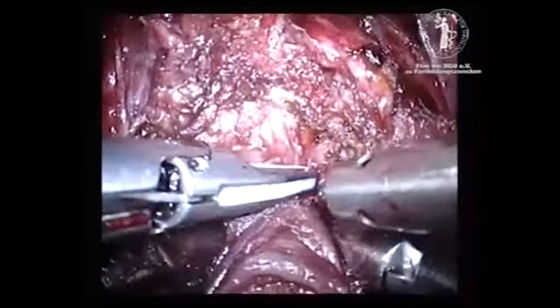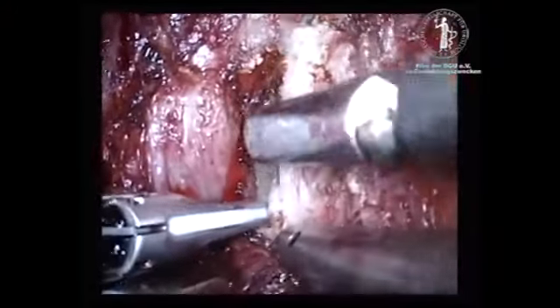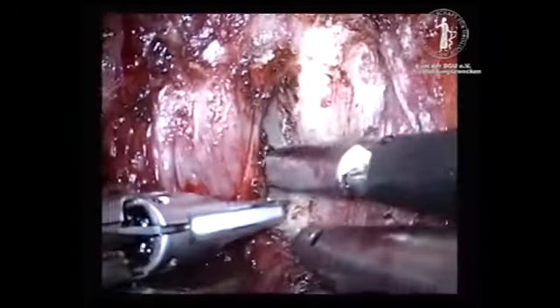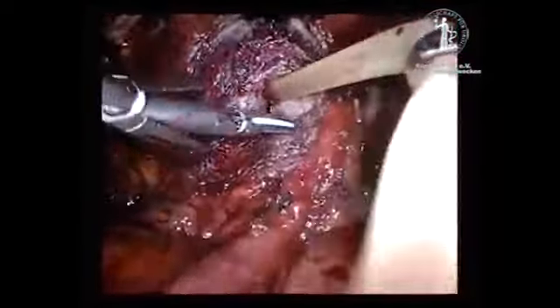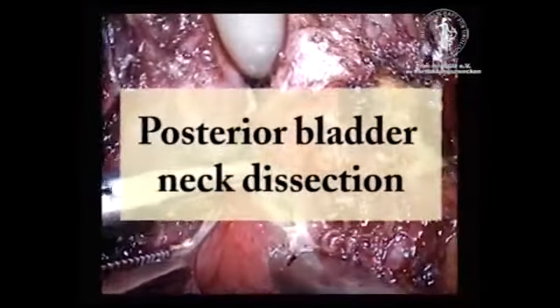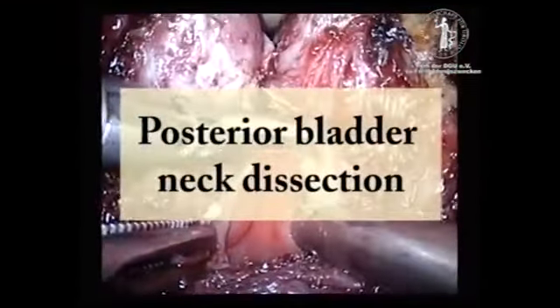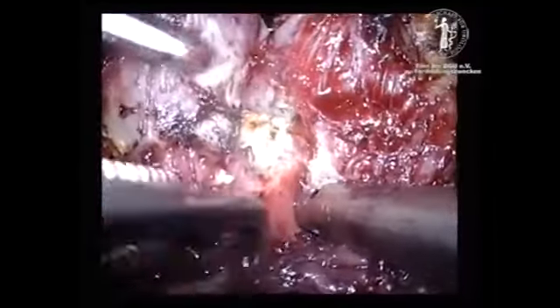When cutting the bladder neck, the assistant and the operator push the bladder dorsally. It is completely incised and the catheter is pulled out into the retropubic space and placed on traction. The dissection of the bladder neck is now continued laterally. The posterior bladder neck is initially completely divided between the 5 to 7 o'clock positions.